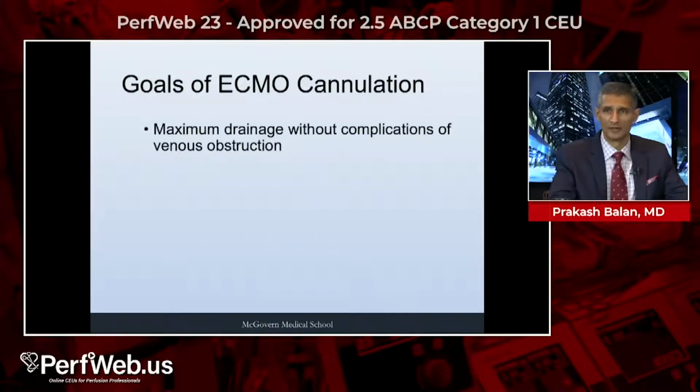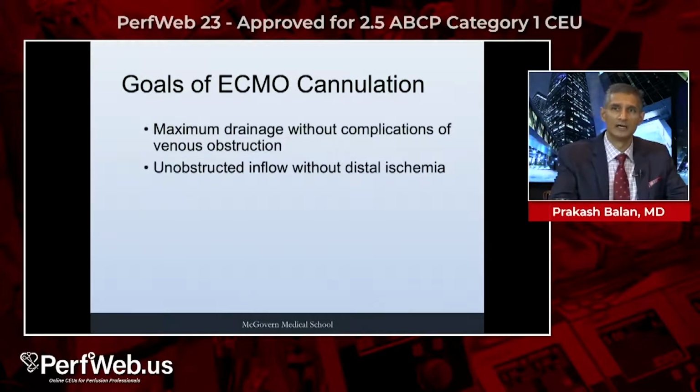Now, what are the goals of ECMO cannulation? You want to maximally drain the venous side and provide unobstructed flow on the aortic side without creating distal ischemia, particularly to the leg. Most often I use the leg.